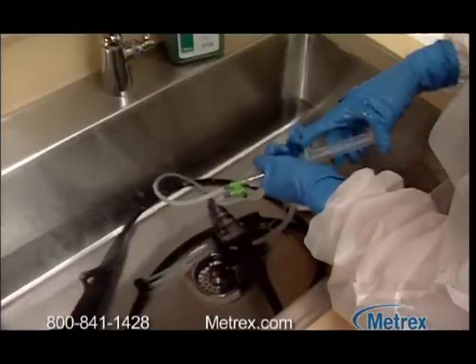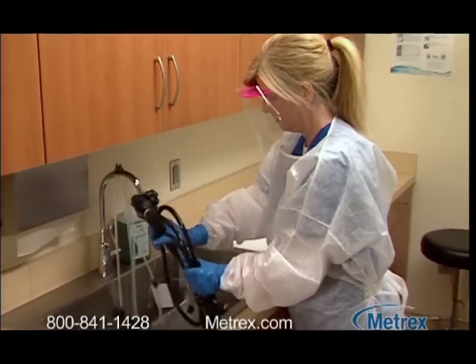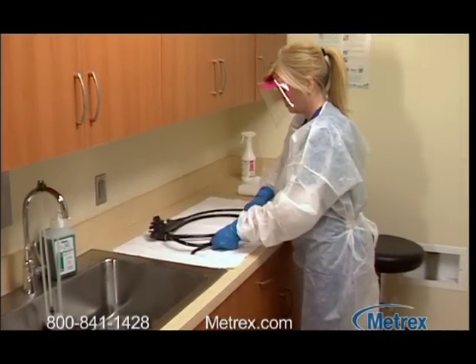Thoroughly rinse instruments with large amounts of fresh water and air or towel dry. Inspect the instrument and, if necessary, repeat the pre-cleaning steps.